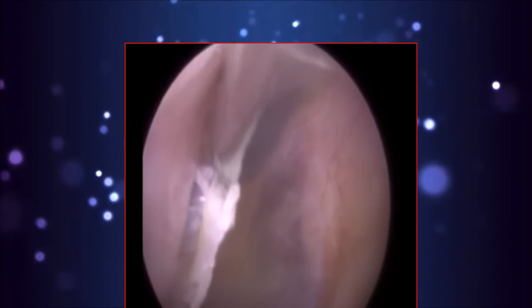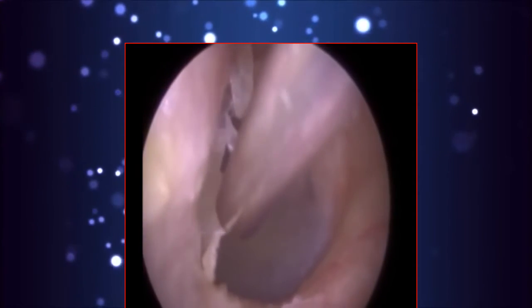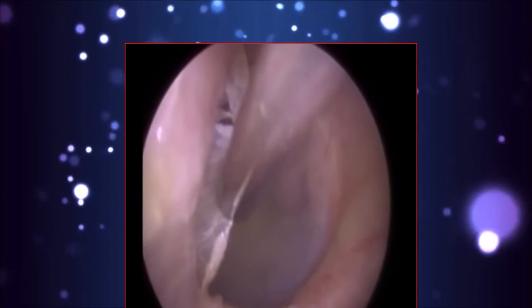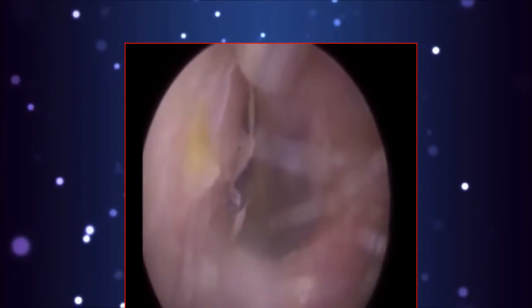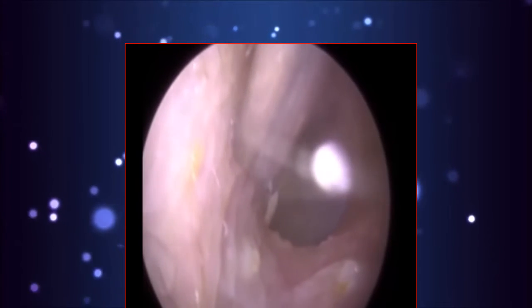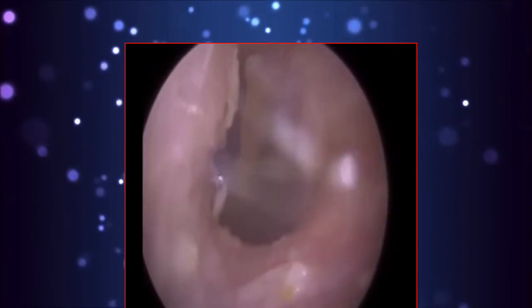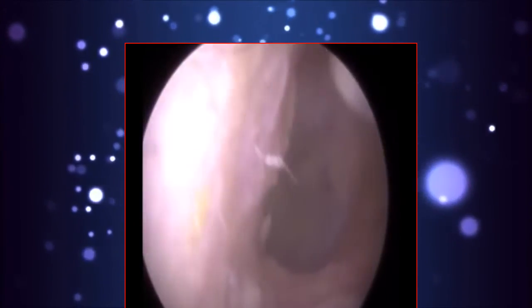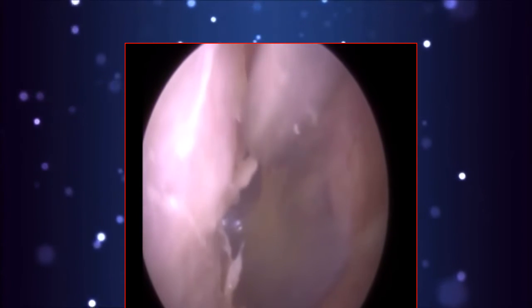So it may look easy on a video, or just a bit of skin there, why don't you just pull it out? Well, it's not as easy as that, believe you me. So we're really tugging away, but I did give it a fair crack. Got the majority of dead skin out. I even used some forceps to see if I can yank and pull. Not a very good technical medical word, but extract and pull, but yeah, to no avail.